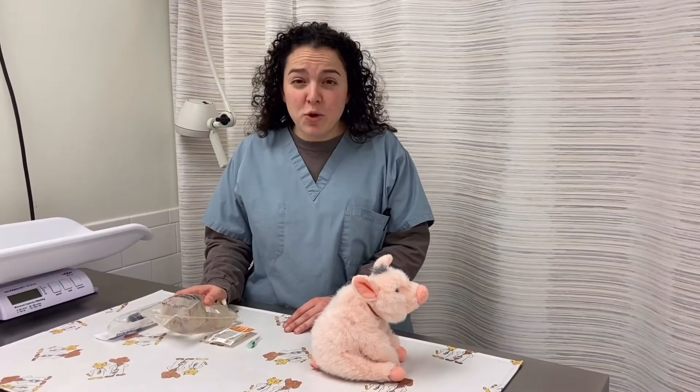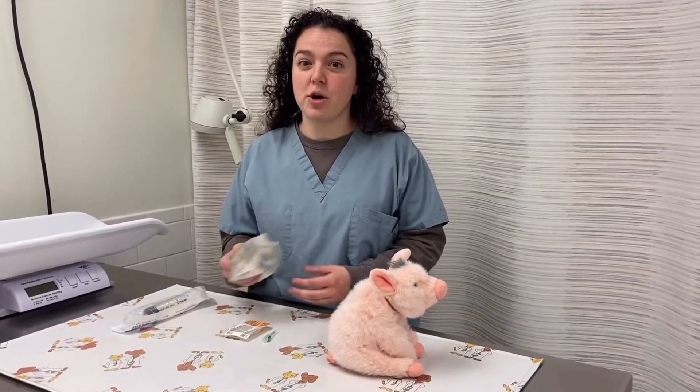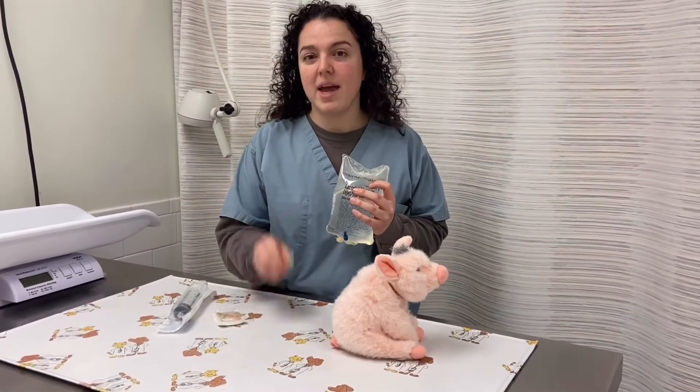Hi, today we're going to go over sub-Q fluid administration using the syringe method. So you want to make sure you have all your supplies: your bag of fluids, a syringe, a butterfly needle, and a needle.